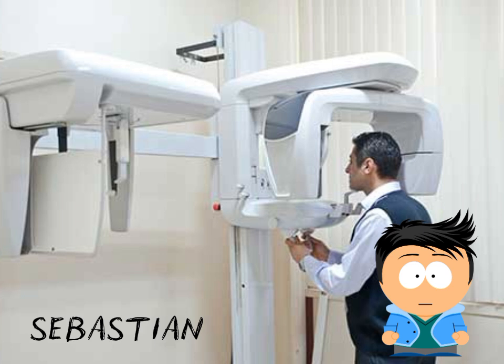The panoramic dental X-ray equipment is a diagnostic device, an orthopantomograph, that is used to capture 2D images of the jaws, teeth, TMJ, and sinuses. It is essential for evaluating dental pathologies.